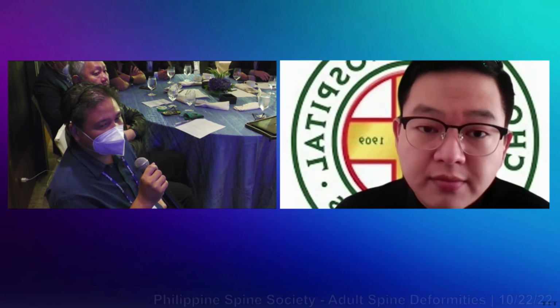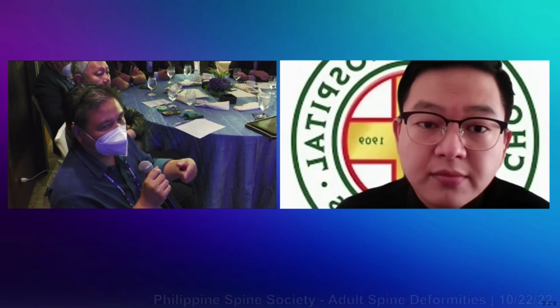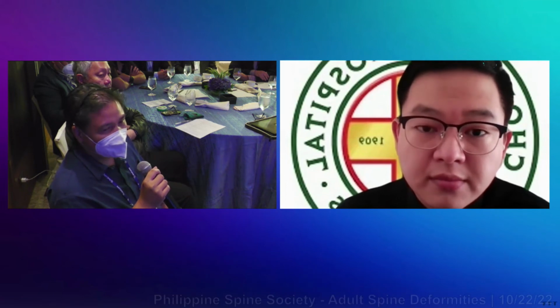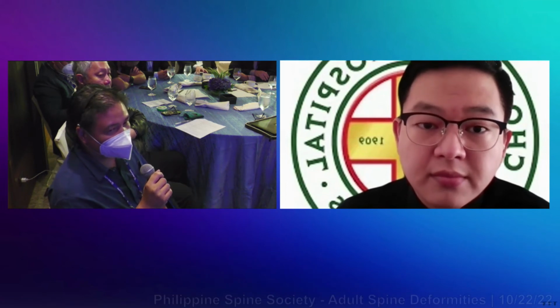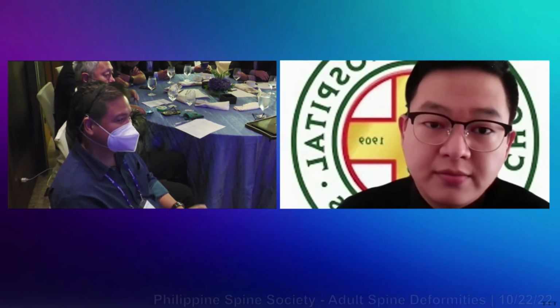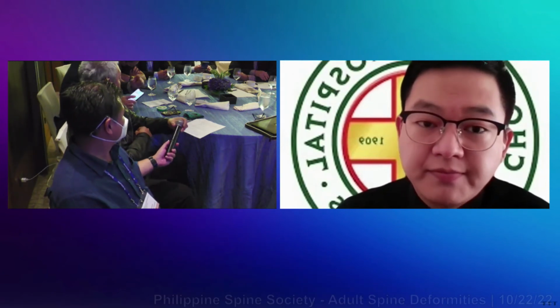Kasi yun yung isang pwede maging problema, di ba? If you have a persistent CSF leak that can lead to pseudarthrosis, and if you have pseudarthrosis, then eventually your construct will fail. Yes, sir. Thank you, sir.